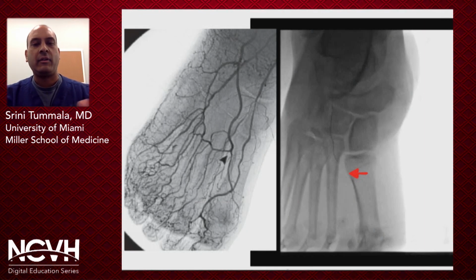Remember, it never looks like the picture on the left. That is a normal person and their pedal loop. You never have a beautiful roadmap like this, but what you want to use is certain landmarks that I showed you. So if you watch this video on the right, there's your normal pedal loop.